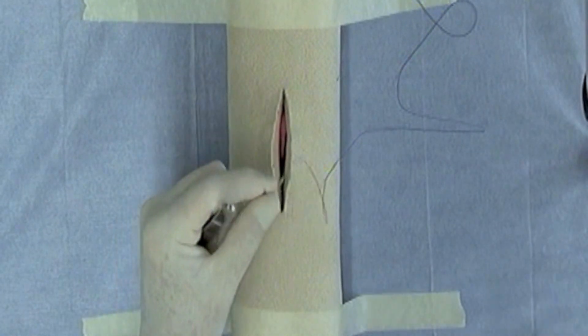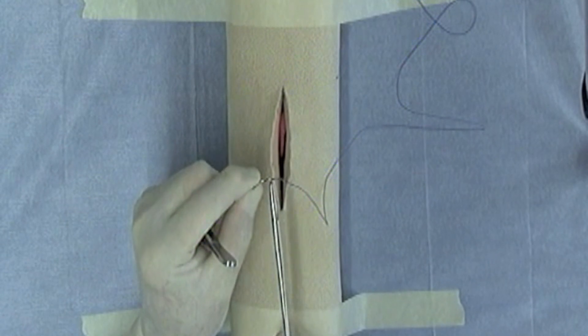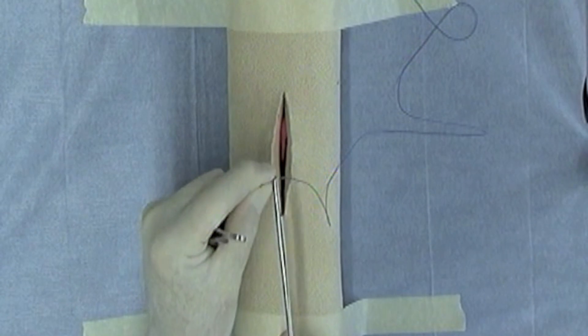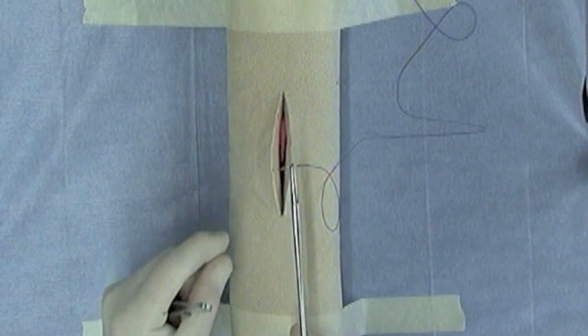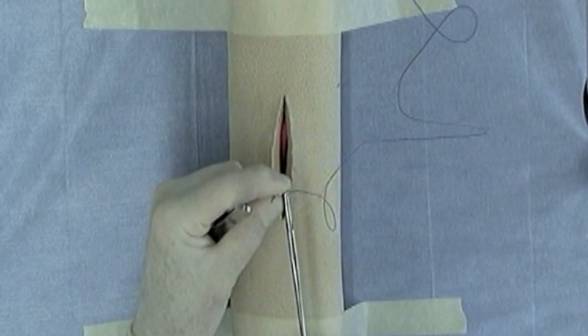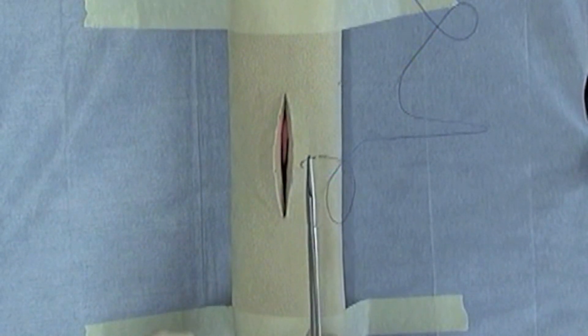To properly apply the needle to the needle holders, you want to grab the needle right at the center or just slightly behind center toward the swagged on side of the needle. Also, you want to put the needle in the needle holders right at the tip and you want to clamp.